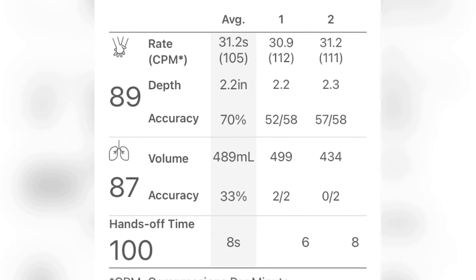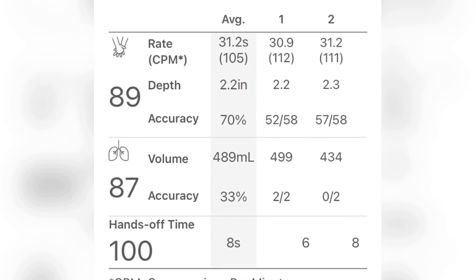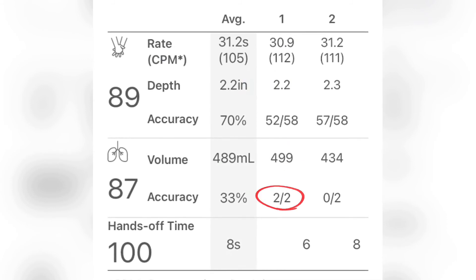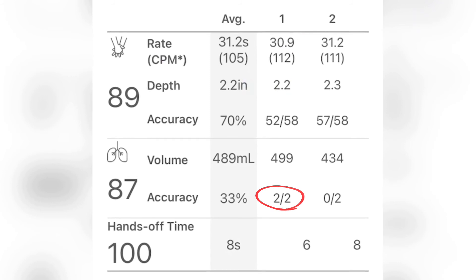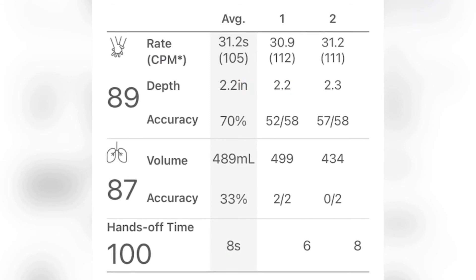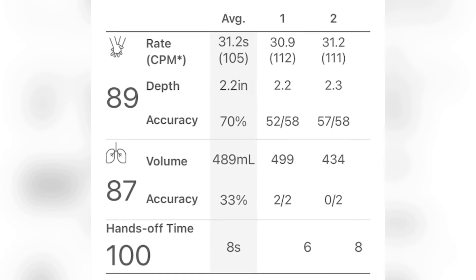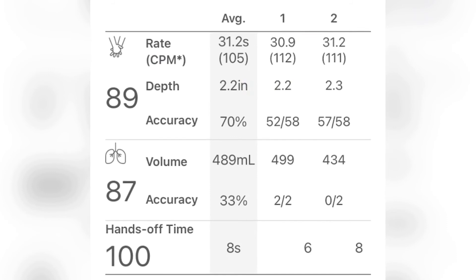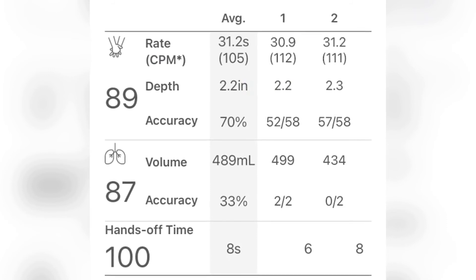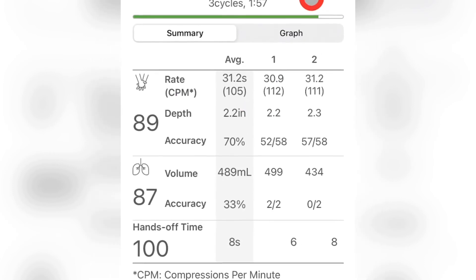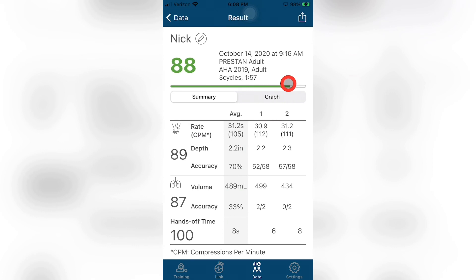Next is the ventilations category. In this category, you will notice the top number shows the maximum volume of any breaths performed in the cycle. The bottom number will show the ratio of good breaths over the total breaths performed within that specific cycle. Lastly, hands-off time is the amount of time that has elapsed between when compressions were stopped for performing a ventilation cycle and when compressions were restarted after the ventilation cycle was complete. If more than two cycles were completed within a training session, the additional cycle data can be viewed by pressing anywhere within the table and dragging your finger to the left to reveal any additional cycles and their respective data.